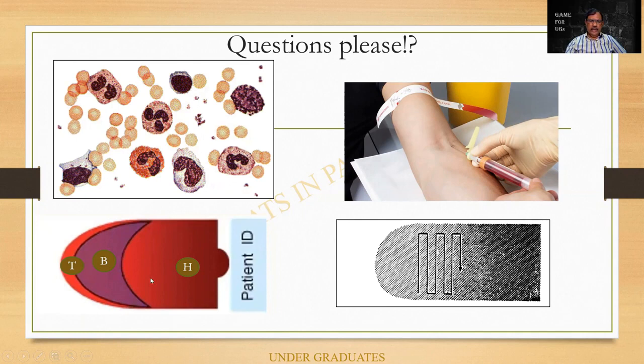Second one is the body, and here it is also fairly dense, but as we go towards the tail, the cells tend to get distributed. They say, in fact, the junction between the body and the tail will be apt for the study of the morphology. And this incidentally indicates a method of counting. We shall be going to it later on. So this particular slide shows you how much can be learned and answered in a peripheral smear.